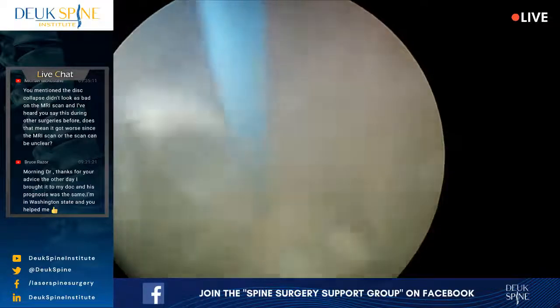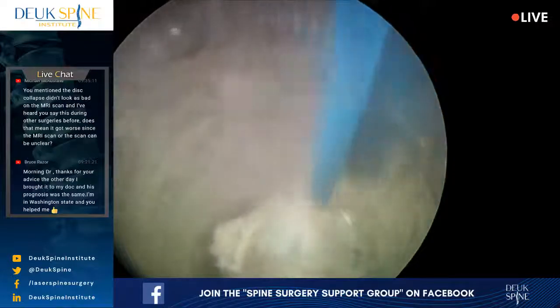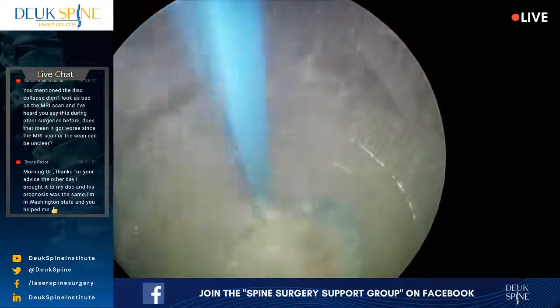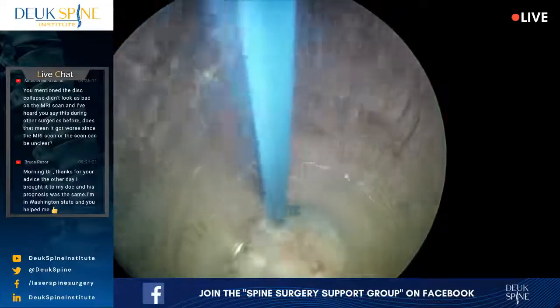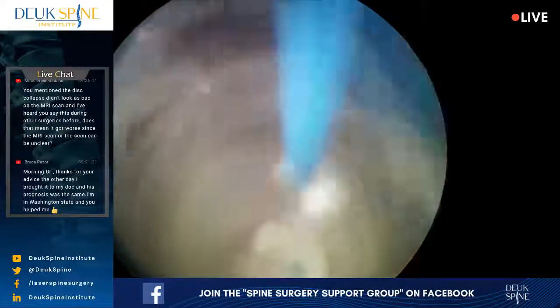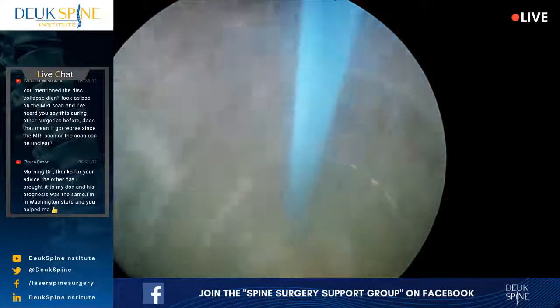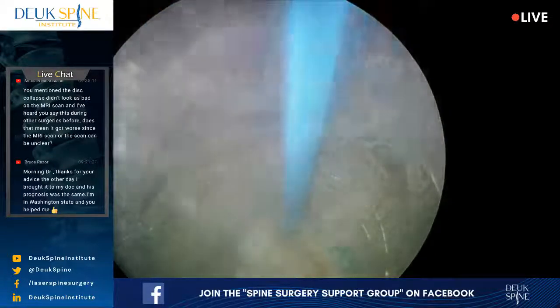Even the Laser Spine Institute that used to say they did laser spine surgery, I had friends who worked there as surgeons. They never used the laser. They just used it as a marketing gimmick. But with this procedure you're watching now, you have to use the laser. The laser is the only way to get rid of the scar tissue. No grabber, no shear, no other surgical tool that surgeons usually use will work. Trust me, I've tried it. It doesn't work. The only thing the grabbers do is take away chunks of disc herniation once you've freed them up from the scar tissue in the annulus.